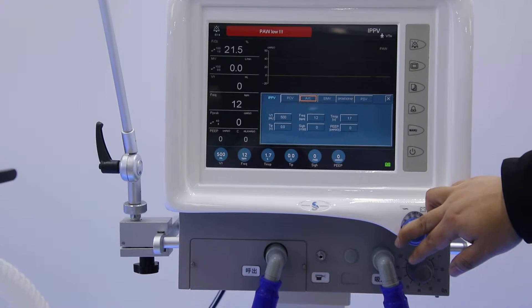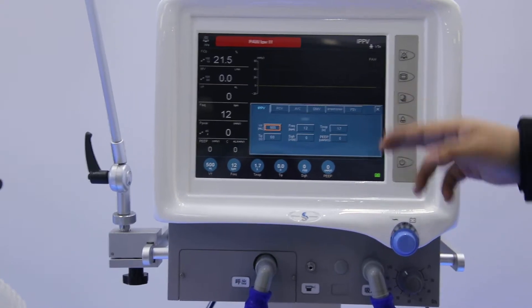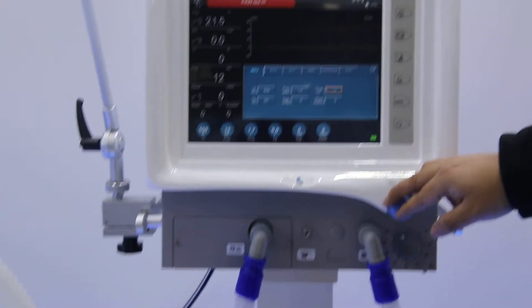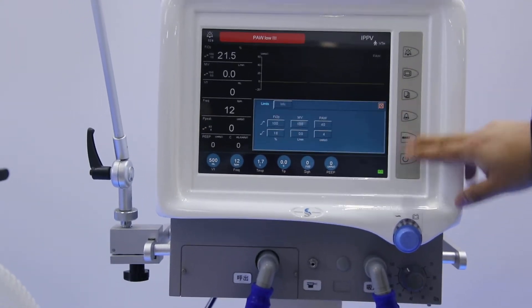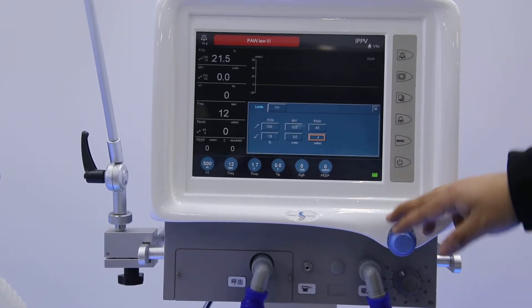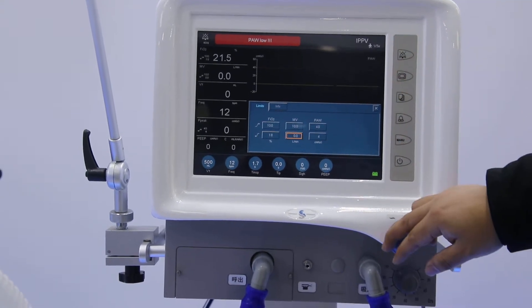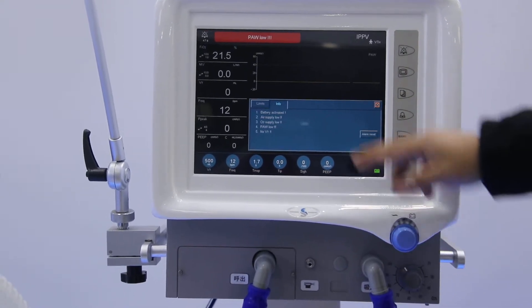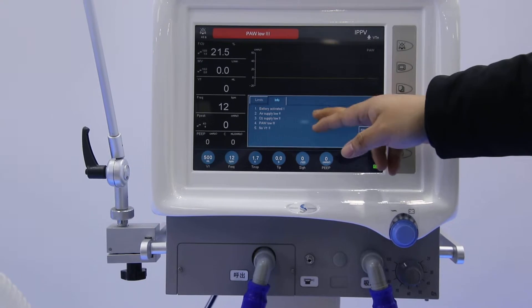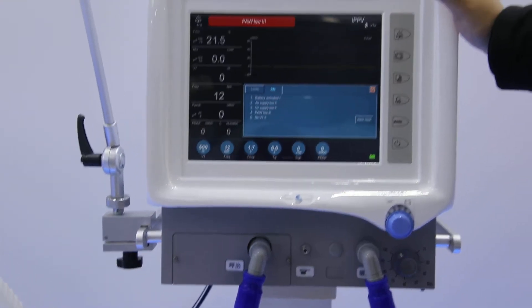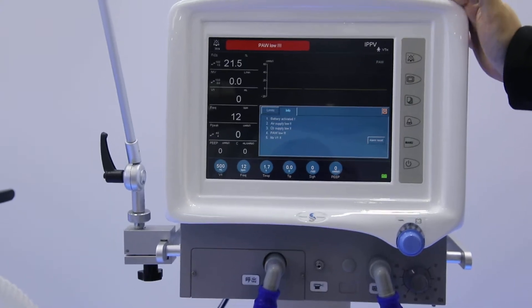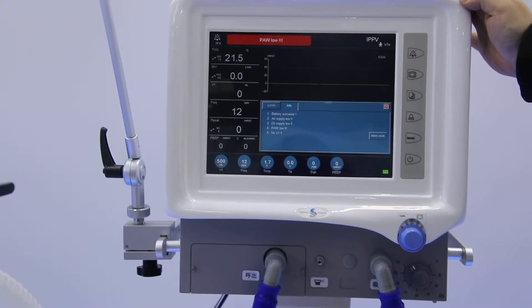The third button here is for changing the ventilation mode again when you change to another patient. The fourth one here is the alarming area. It means it will also be showing the alarms here, the history alarm. And then after several months, if the engineer comes to do the maintenance, they will know what problem caused the ventilator and we will know how to fix it.